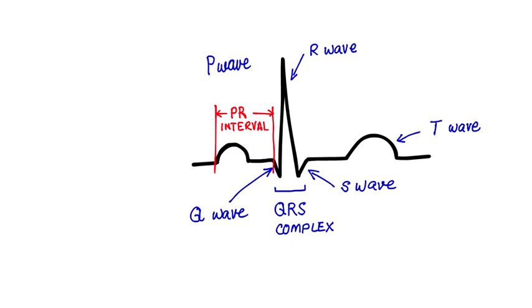Now there is T wave as well, which is ventricular repolarization, and we have explained in the past that the T wave for the ventricular repolarization is a positive deflection instead of a negative deflection. Ideally, if the QRS complex is positive and that is depolarization, then the repolarization should be a negative deflection.